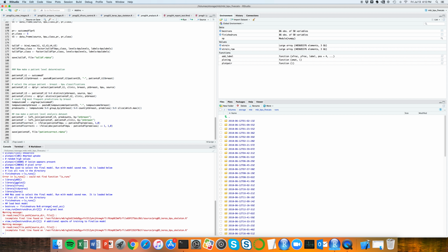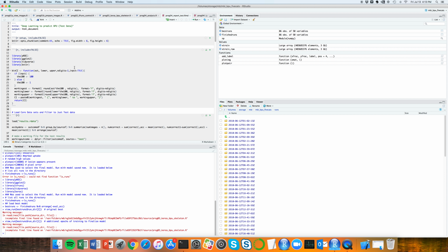And in terms of the radiologic task, each breast is examined. There are up to 4 images per breast included, and the model that we fit treated each image independently. At this point, I can save out all these data objects, so you need to utilize a GPU for all the learning. Even the prediction methods require a tremendous amount of computing capacity. But once you have those predictions, you can save them, and then you can do relatively routine things.